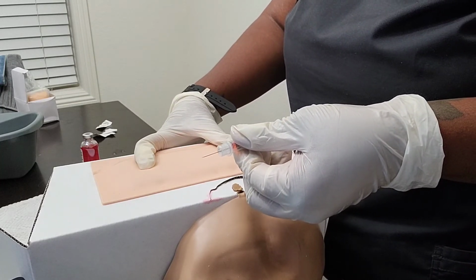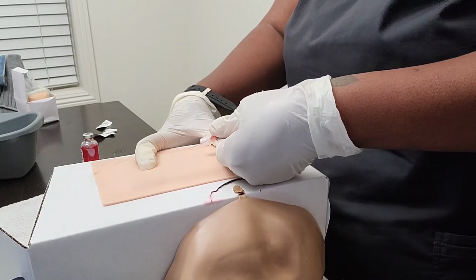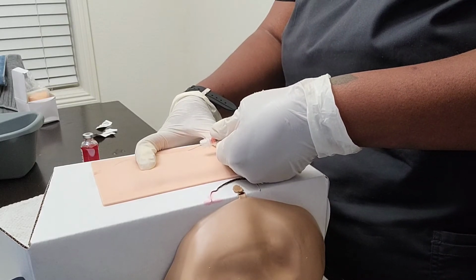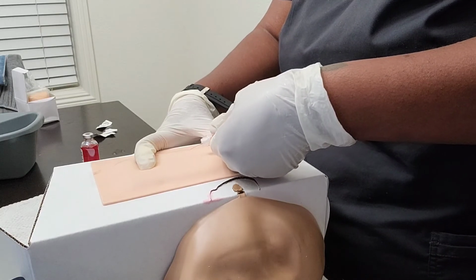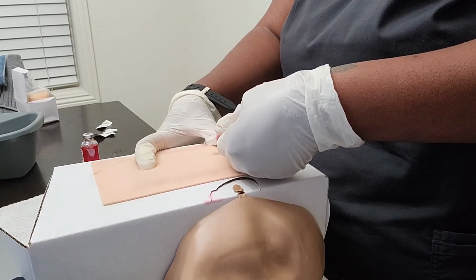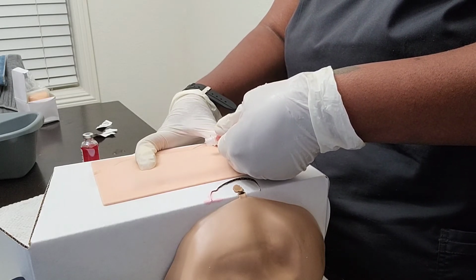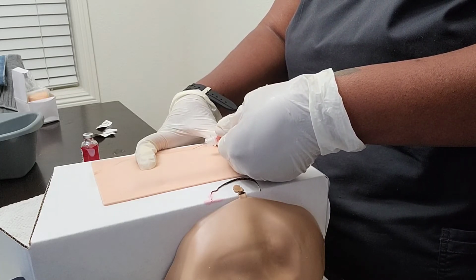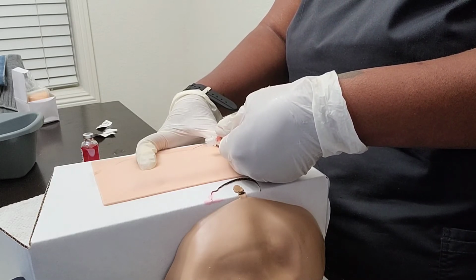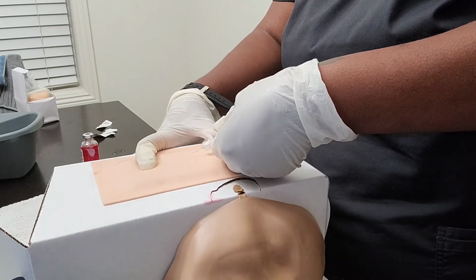And then with the needle, I'm going to make sure that I have the bevel up, and I am doing it at a 5 to 15 degree angle. Make sure that the needle is advancing through the epidermis to a depth of about 3 millimeters below the skin surface. So I should be seeing a bulge from the needle to the tip.